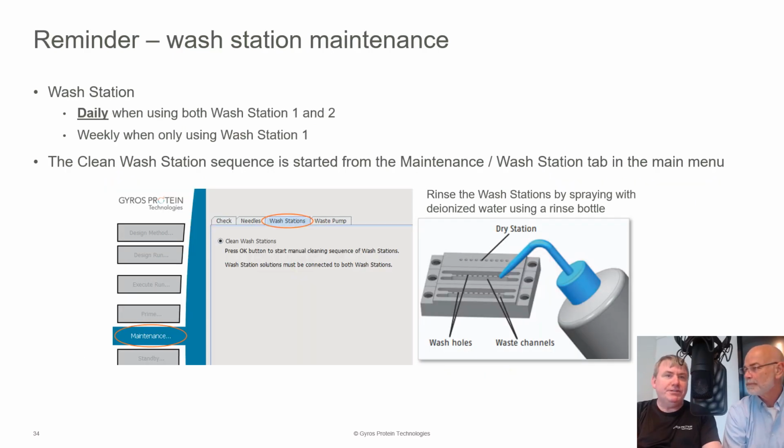Rob, I'll let you describe wash station maintenance, as it's your favorite area. Yeah, exactly. I don't know if favorite is the right word, but it's been the bane of my existence at times. So again, wash station maintenance daily is a good check. It doesn't take but 5 minutes to rinse the wash station down with a little water. In doing that, you're looking to see if there's any evidence of crystallization around wash station 2, particularly because you're using that pH 11 buffer, which we know has a propensity to clog things up.